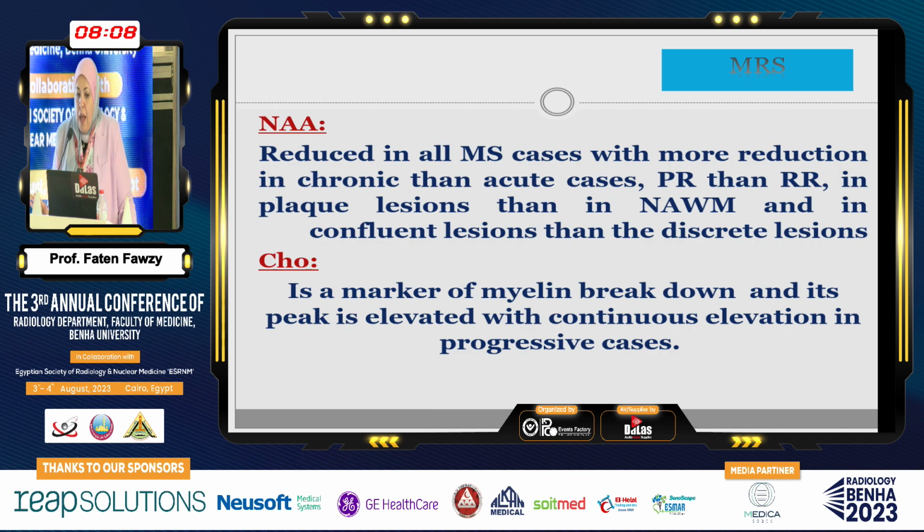N-acetylaspartate as a marker used accurately in MS, as it is reduced in all cases of MS, with more reduction in chronic than in acute cases, progressive than relapsing remitting, in the plaque lesions more in the normal cord, and in confluent than in the discrete lesions. Choline is the marker for the myelin breakdown, so it's used for early diagnosis of the demyelinating process. Its elevation and continuous elevation is seen in the progressive MS cases.